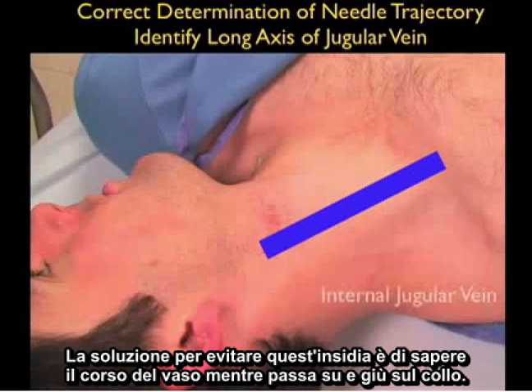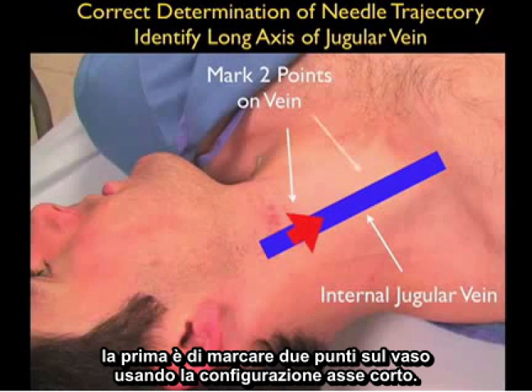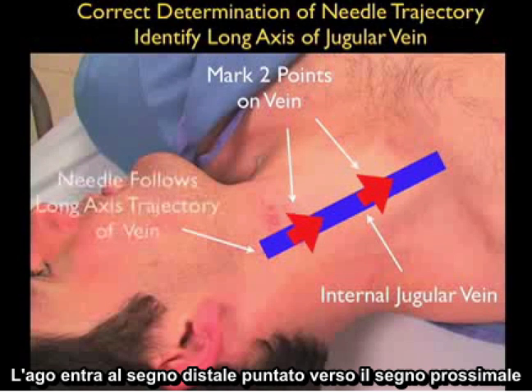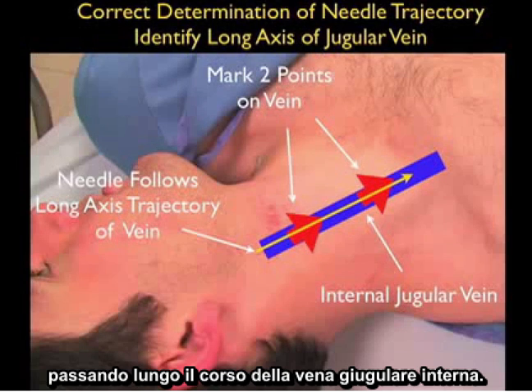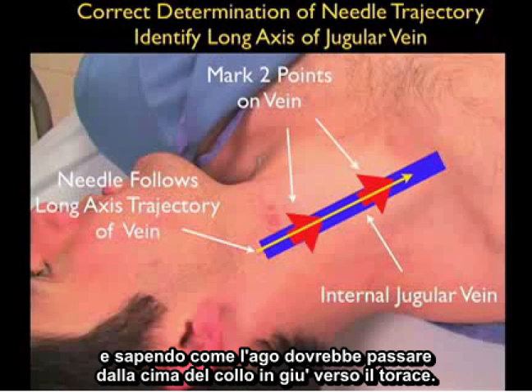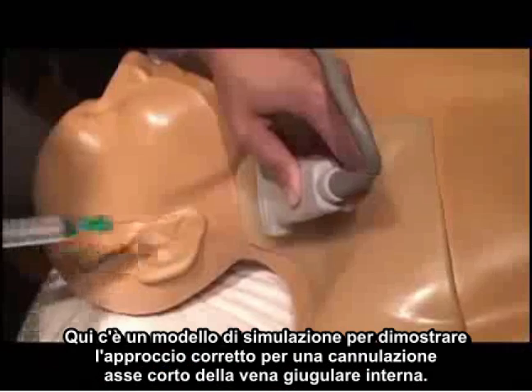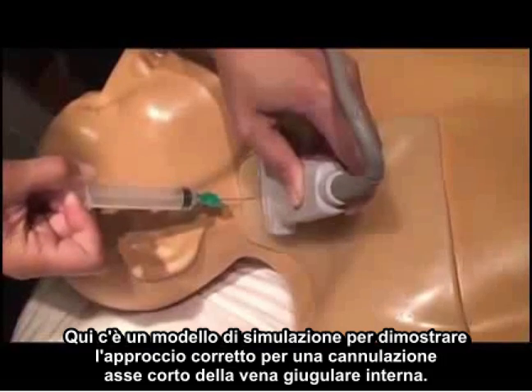The solution to avoiding this pitfall is to know the course of the vessel as it runs up and down the neck. We can do this in two ways. The first is to mark two points on the vessel using the short axis configuration — the needle would then enter at that distal mark and aim towards the proximal mark passing along the course of the internal jugular vein. We can effectively do the same thing by passing the probe in the long axis configuration and knowing how the needle should pass from the top of the neck down towards the chest. Here we use a simulation model to show the correct approach for a short axis cannulation of the internal jugular vein.